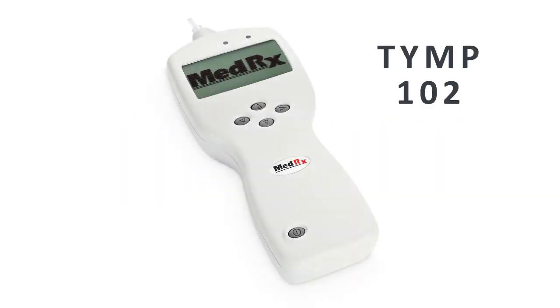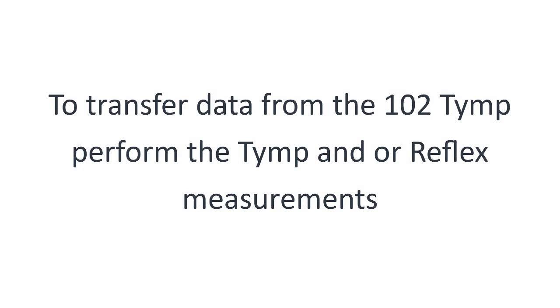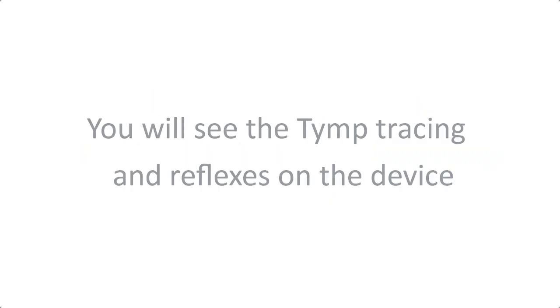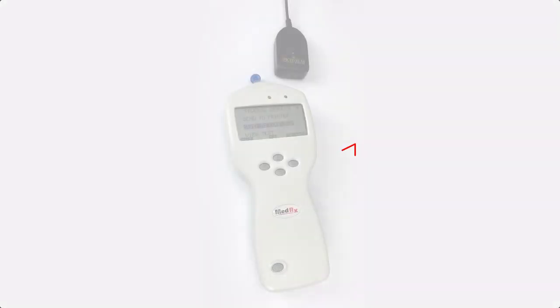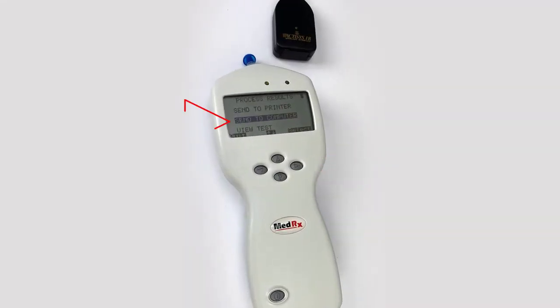Tymp 102. To transfer data from the 102 tympanometer, perform the tymp and or reflex measurements. Place the tymp IR port about an inch away from the IR link. Press the right arrow on the tymp. You will see the tymp tracing and reflexes. Select send to computer.